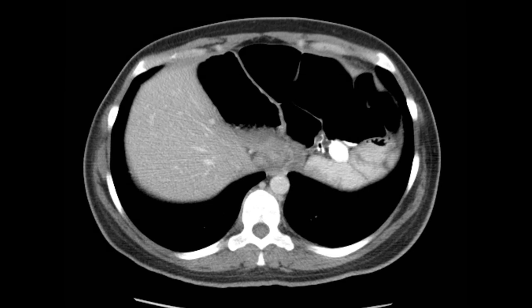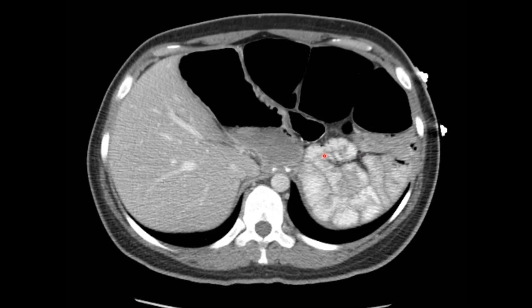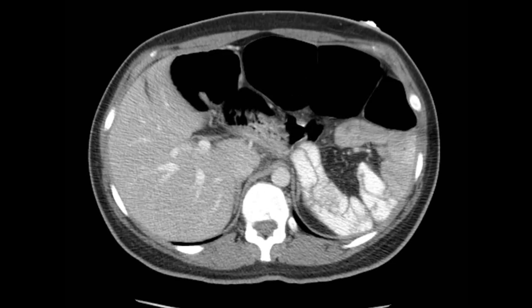Here we're looking at a CT of the upper abdomen at the level of the liver, done with intravenous and oral contrast. We can see the left diaphragm here, but where's the spleen? Instead we see clustered small bowel in the left upper quadrant. It looks like jejunum because the small bowel folds — the valvulae conniventes — are close together, which is typical for jejunum. But where is that spleen?